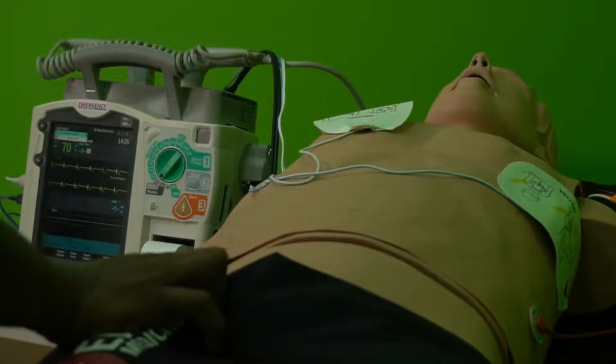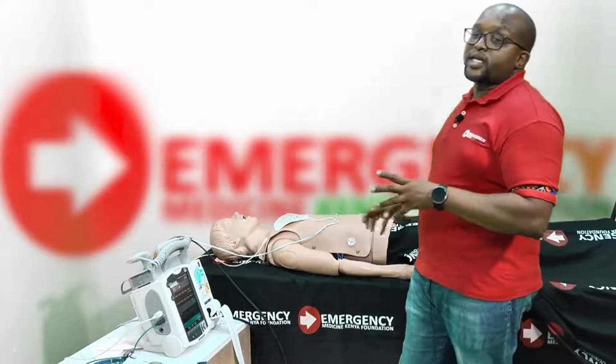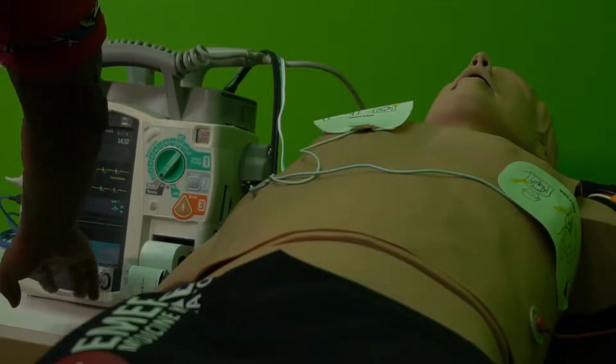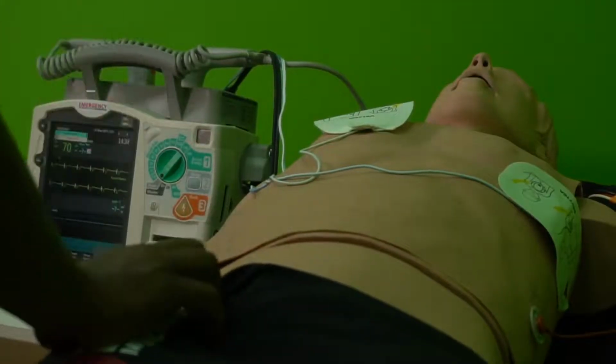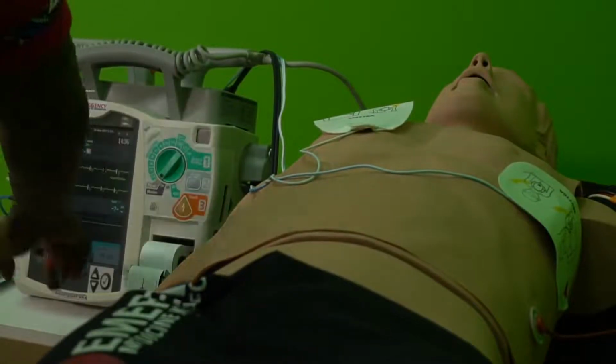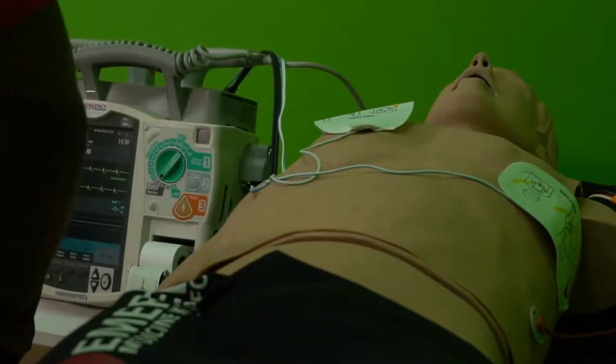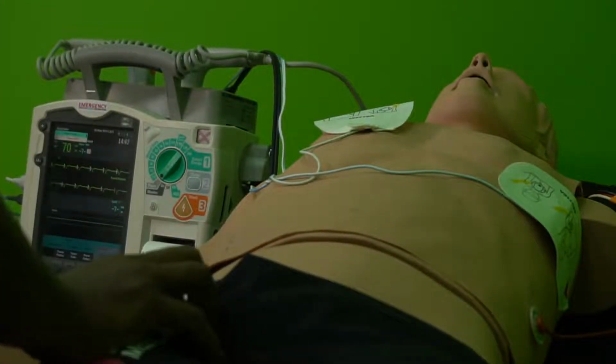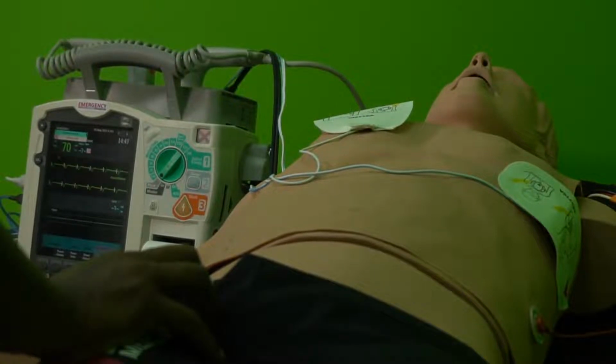Essentially that means I need to increase the amount of energy going to the patient. So we were giving 70, but I cannot get any mechanical capture, in which case I'll go up to 75. I can even just go to 80 and check again. And yes, now the pulse is getting up.